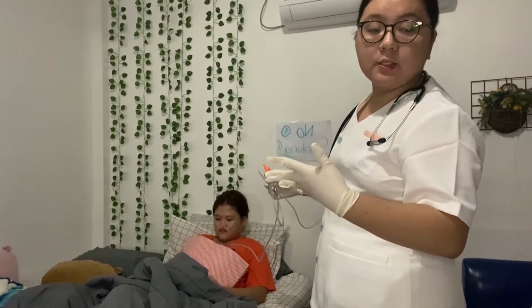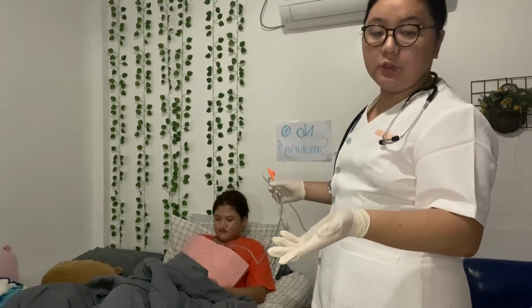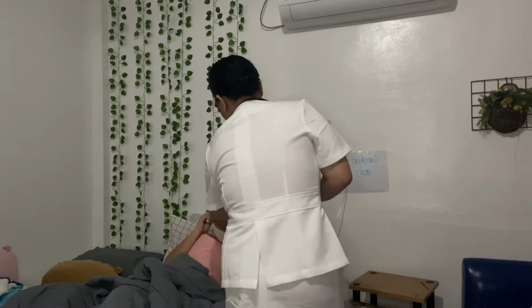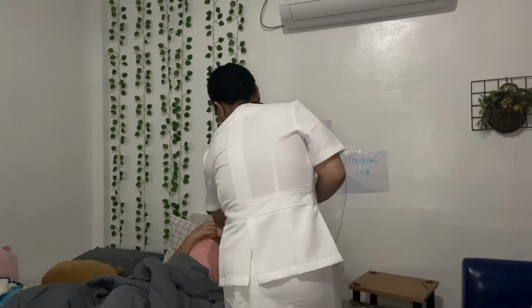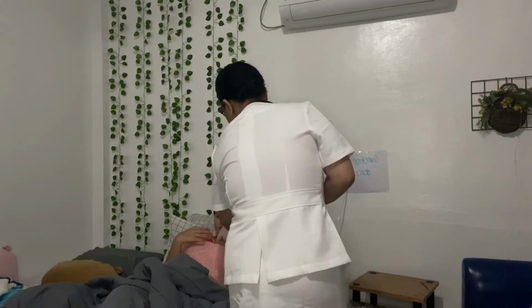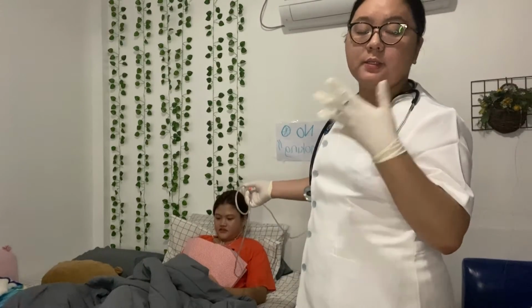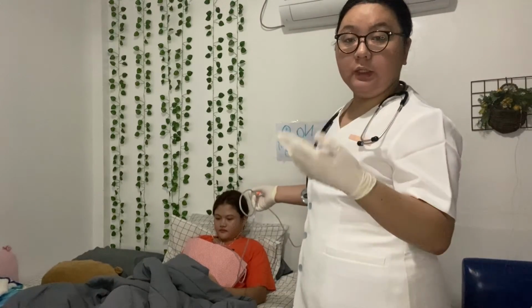Hyperinflate and or oxygenate clients before suctioning. I'm going to remove her oxygen. And then after that, still safe and quality nursing.